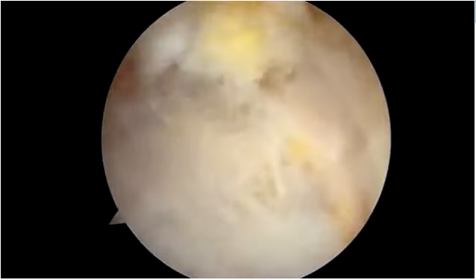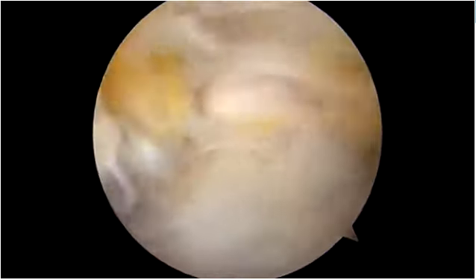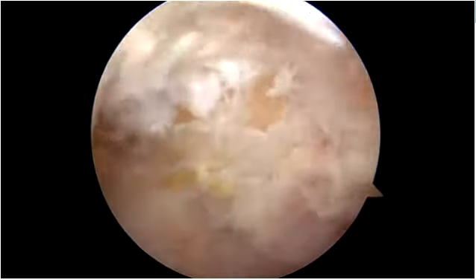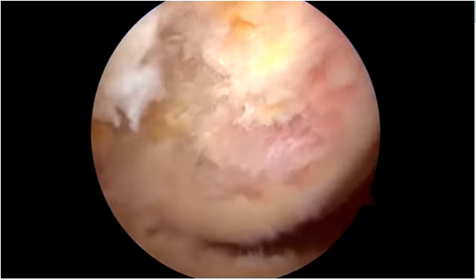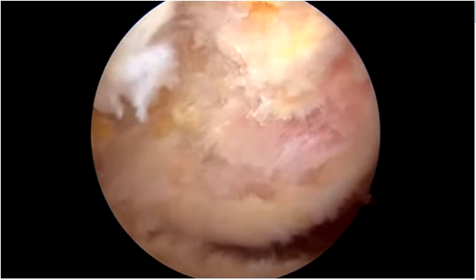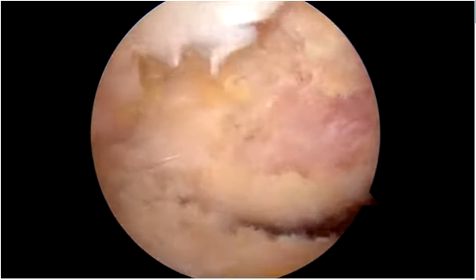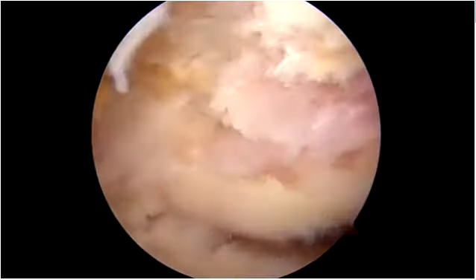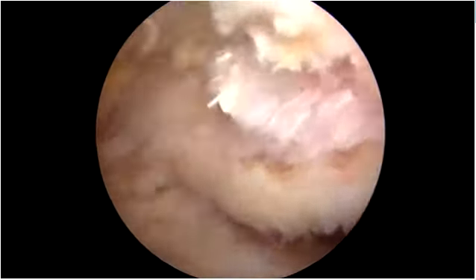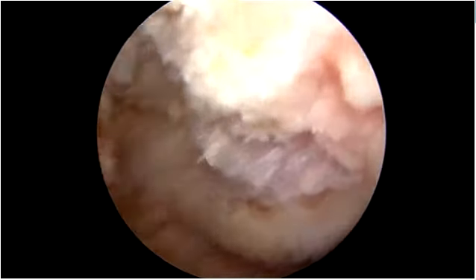Yeah, so now the scope is on the lateral side, and we look at the medial wall, as you see here. Can we turn up the volume a little bit for Roman? Sure. Yeah, so now we have a look at the medial wall, and you see that this patient has a huge osteophyte here, so there's no problem to find the cartilage border.